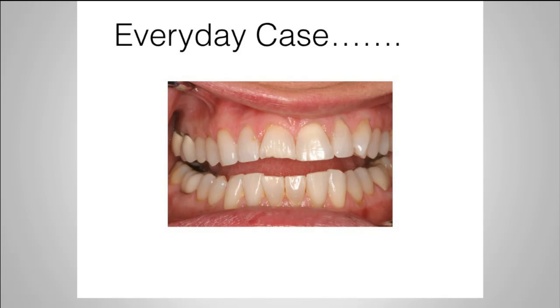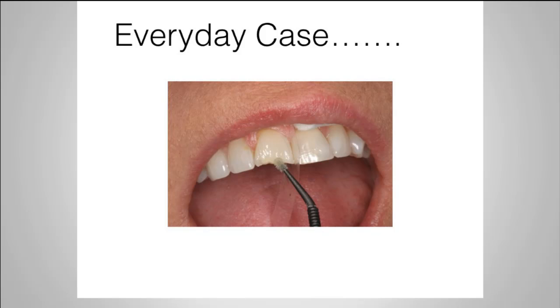So doing what we do best, a little bit of small preparation on that tooth, no anesthetic needed in a small situation like this. I did a little bit of a starburst pattern to help with a little bit of opening up of some of that enamel and a little bit of the overall blend process in the final result. I go ahead and use my OptiBond XTR in a scrubbing fashion for 20 seconds, to help, in the primer stage, open up some of that enamel for better bonding or for adaptiveness.